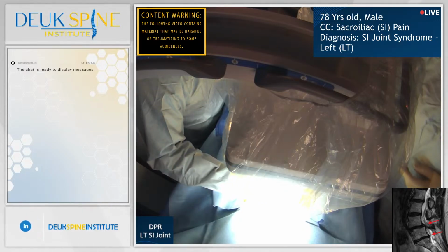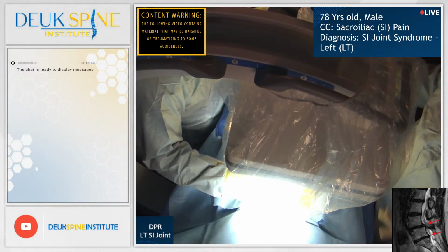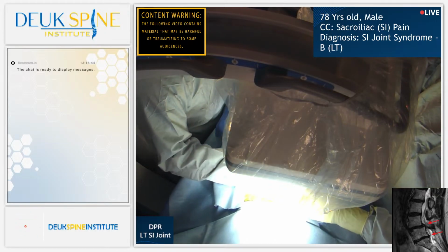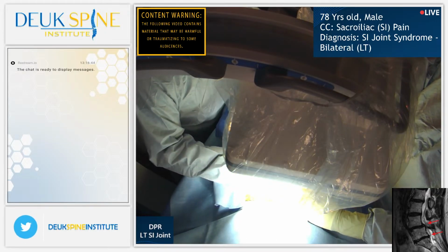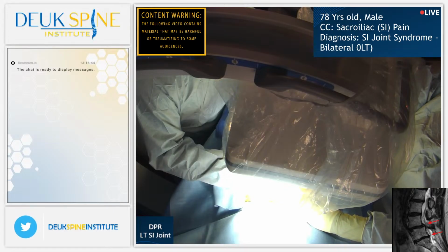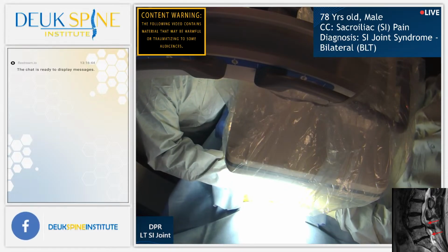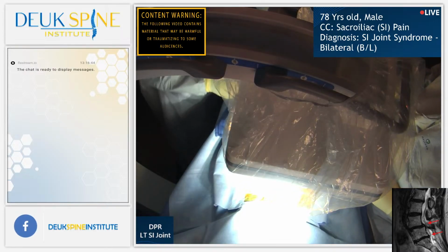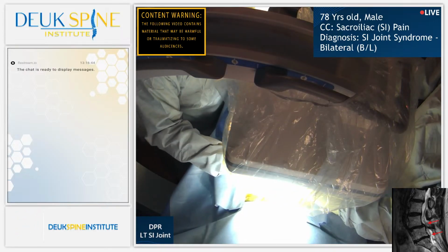Are you ready? Yes. All right, we're going to get started. We're starting with the left side. I apologize. Henry, will you show the audience how we treat the sacroiliac joint pain? Of course.